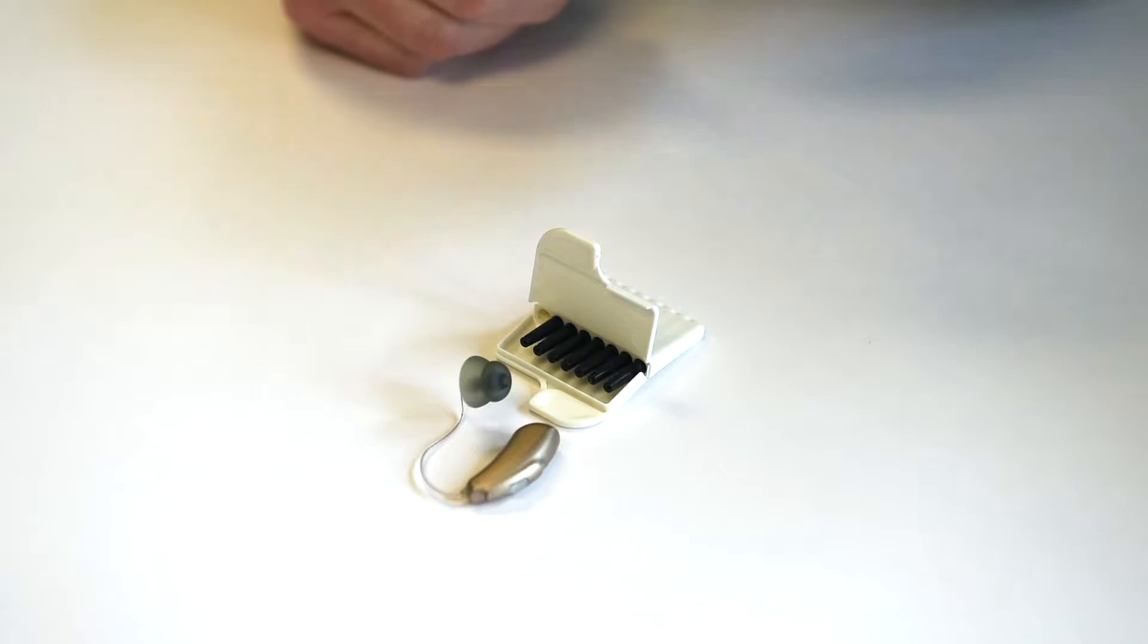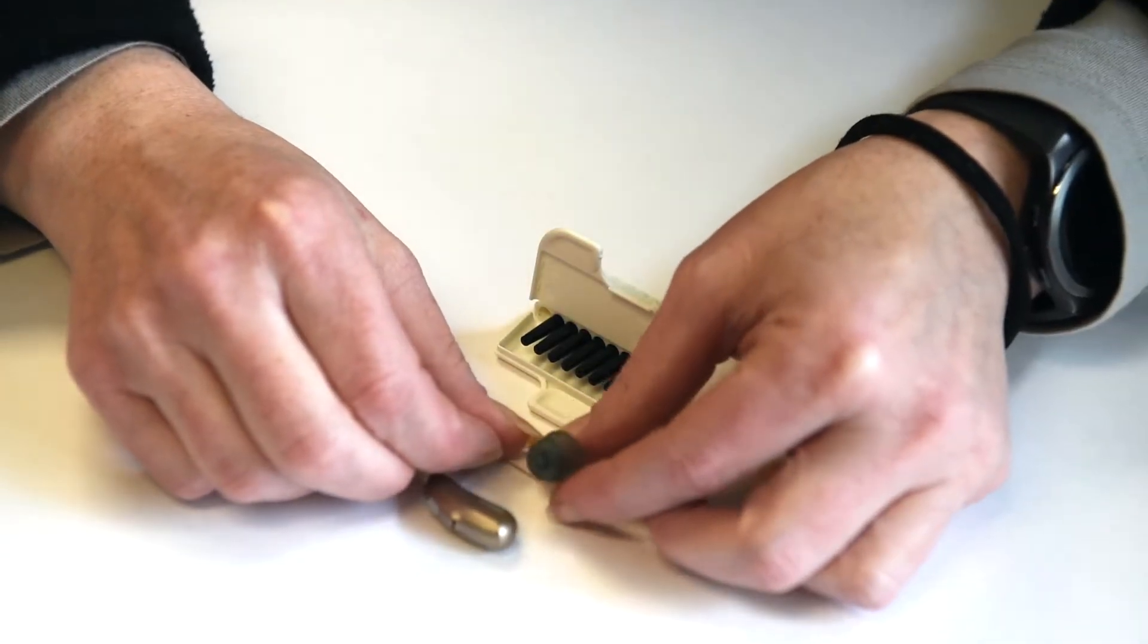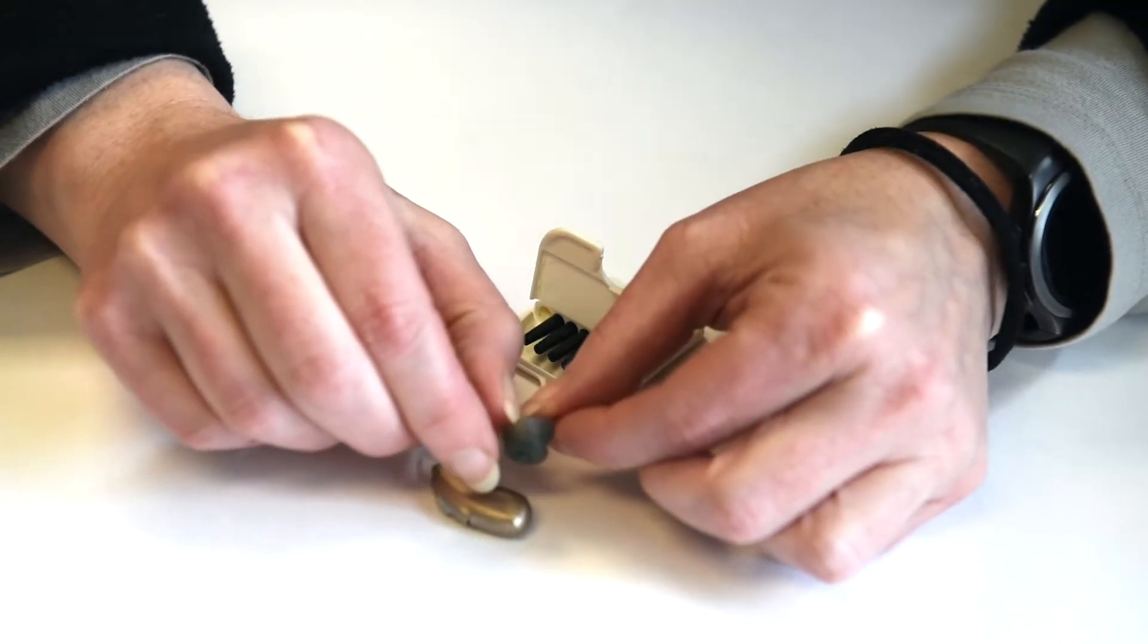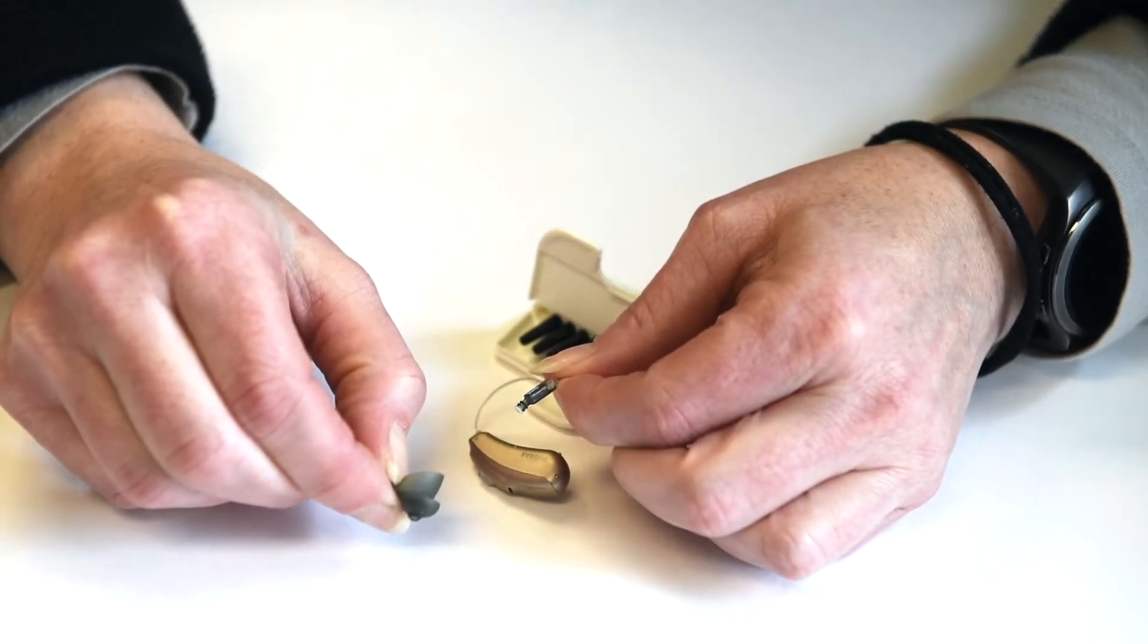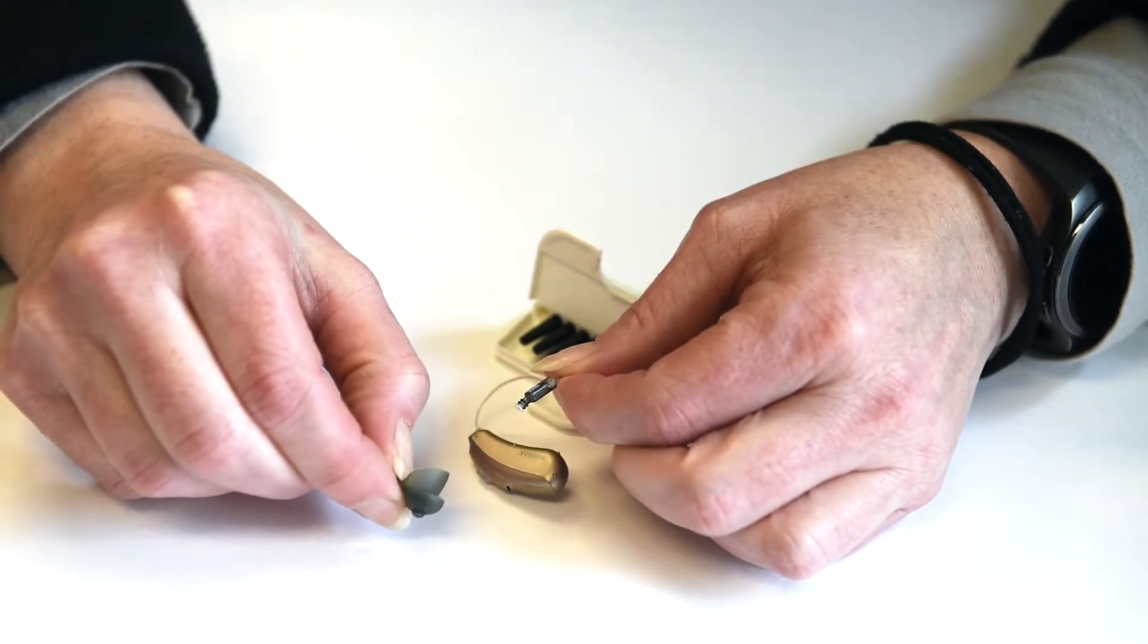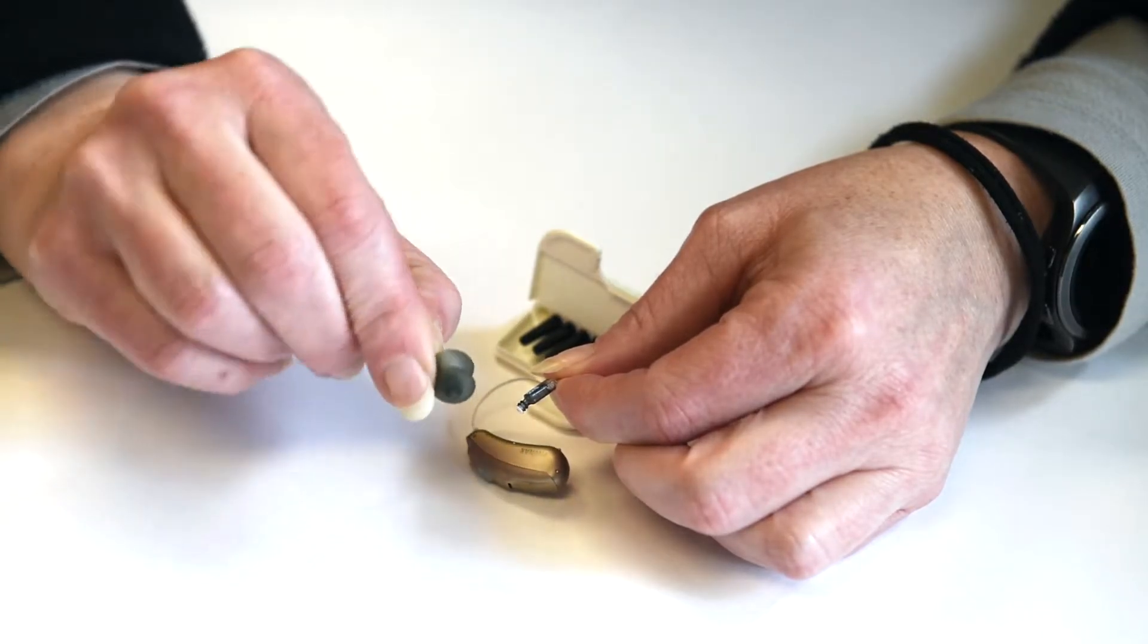The first thing we need to do is pull the rubber tip off of the end. Now your dome might look a little different, that's fine, either way just pull it off. Regardless of what your dome looks like, just pull it off.